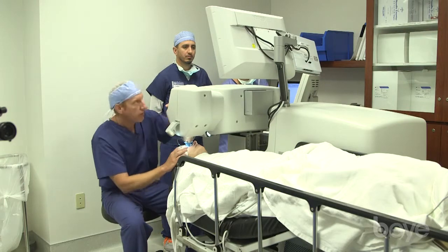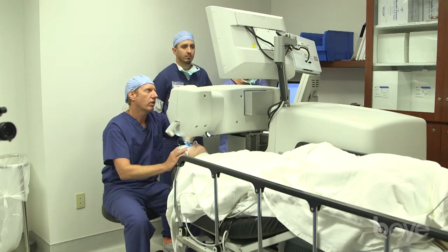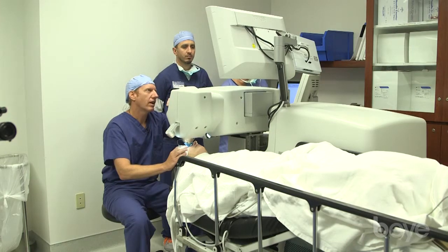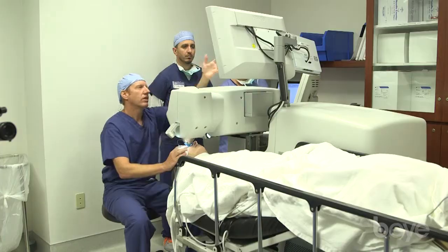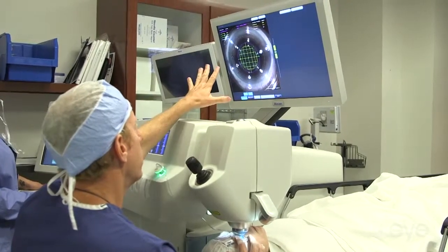Once you get down on the eye a little bit, I start looking at the screen. We wait until the cornea is centered and we get just a little compression, then we ask for vacuum. Vacuum on. You can see that all the bubbles disappear and everything is holding perfectly still.